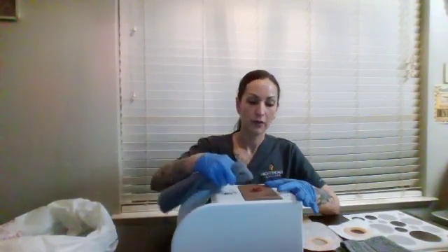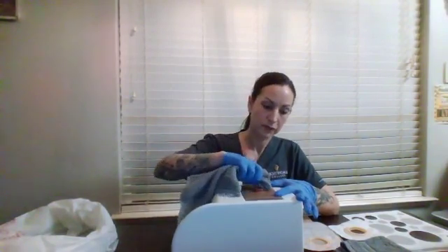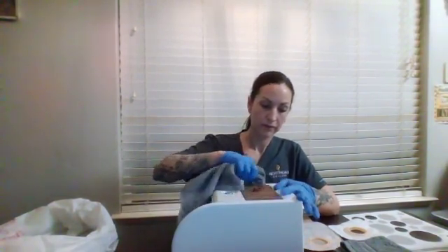Now we're going to take a clean washcloth, warm water, and the approved cleaning solution and clean the stoma. You start by cleaning from the inside out, and then you can toss the washcloth into the garbage.